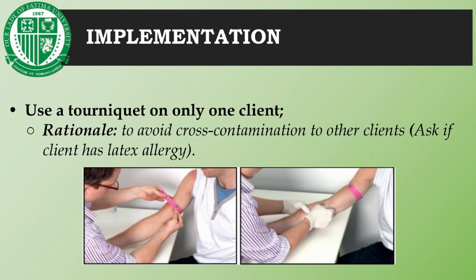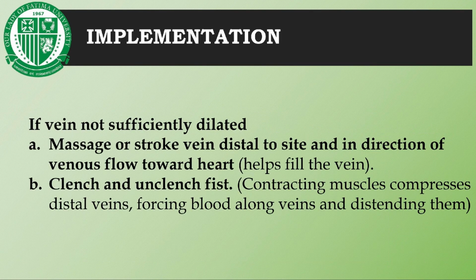Don't forget to ask if the client has a latex allergy to avoid triggering serious allergic reactions, ensuring that all materials and products used are safe for the individual. What should the nurse do if the vein is not sufficiently dilated? The nurse should massage or stroke the vein distal to the site and in the direction of venous flow towards the heart, which helps to fill the vein.